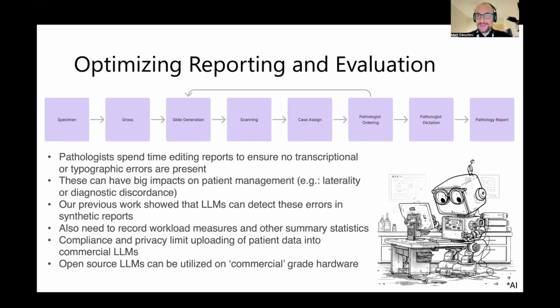Another thing that I spend a lot of time doing is reviewing my reports. I spend a lot of time making sure there's not a transcriptional error or some other kind of logical error in my report. This actually takes up a large part of my day, just making sure my text to speech software didn't put any crazy words in there. This is a big point of stress for me: did I make a typo or something else in the report? Because it's relatively easy to do, especially since these speech to text programs can write words that sound like the word you're trying to say, but really don't make sense in that context.